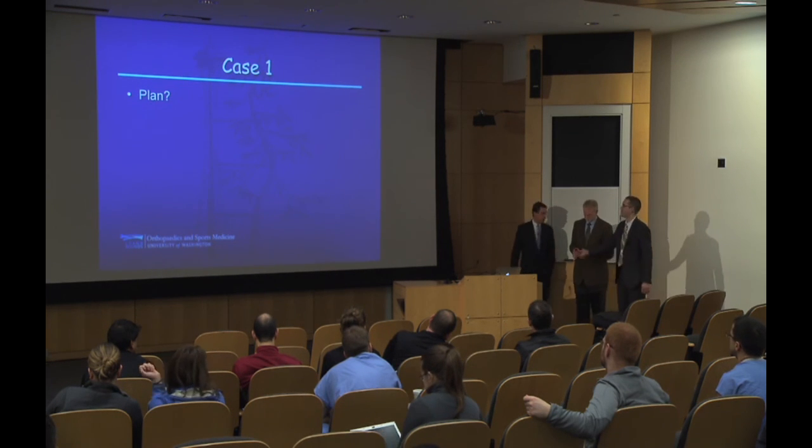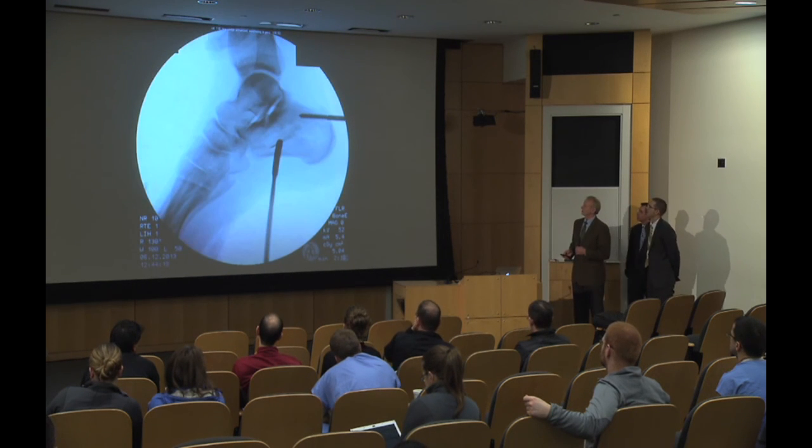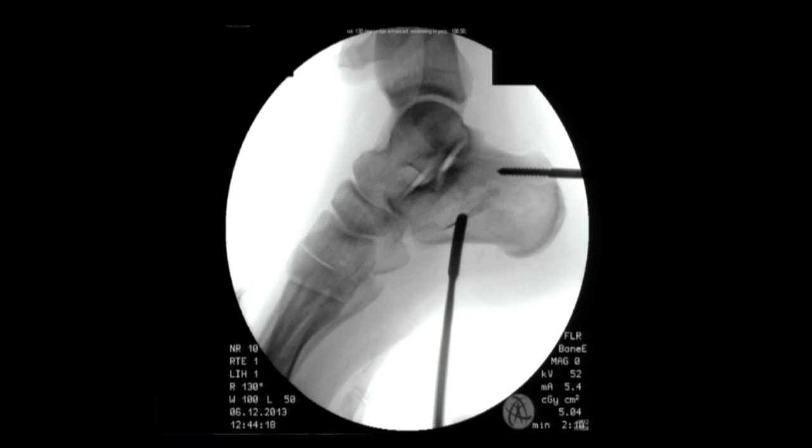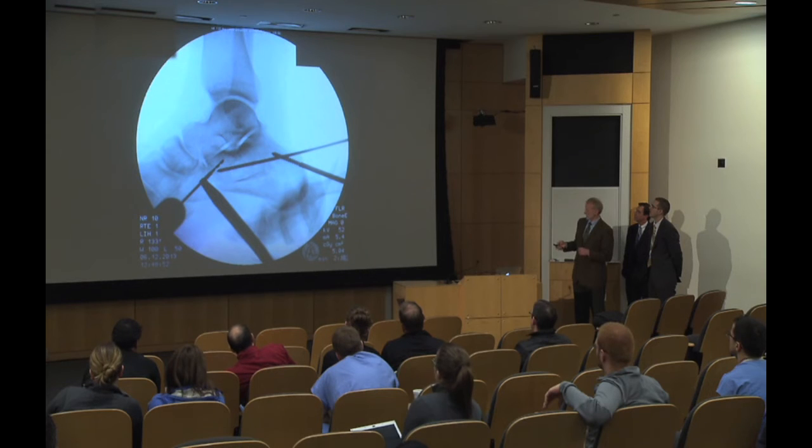This patient ended up in Dr. Sanjorzen's hands and got the minimally invasive technique. So a Schanz pin was placed. The AO elevator is used to push upward on the front as the Schanz pin is used to rotate until this piece is down. You can see that this patient started out in a little bit of a cavus configuration, so you have to tuck the top of the tuber in and then place fixation across that fracture line, which is going in this angle. And the anterior process had to be secured so that this screw would have something to bite into.